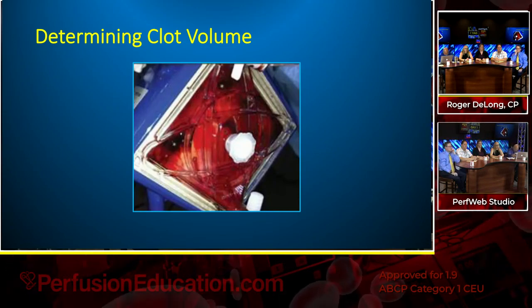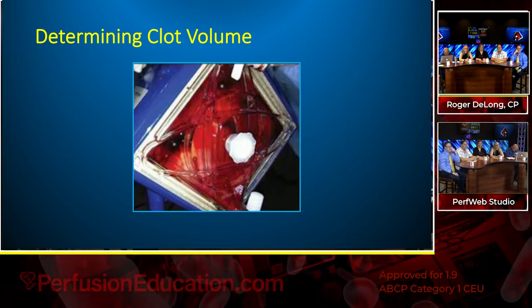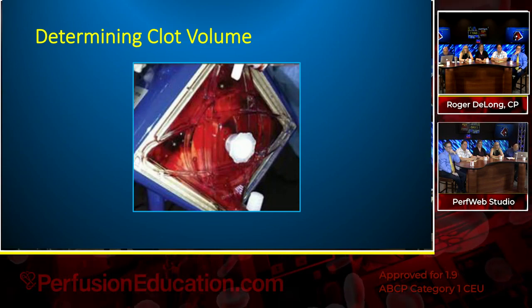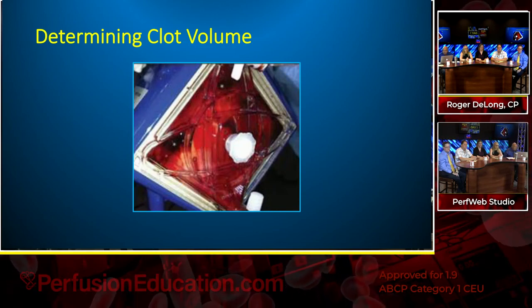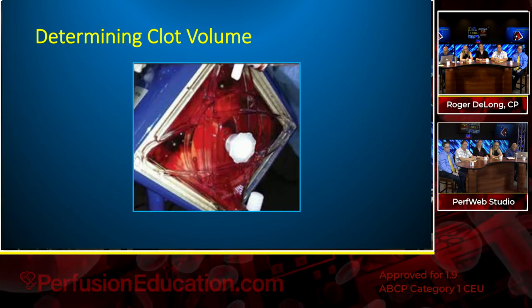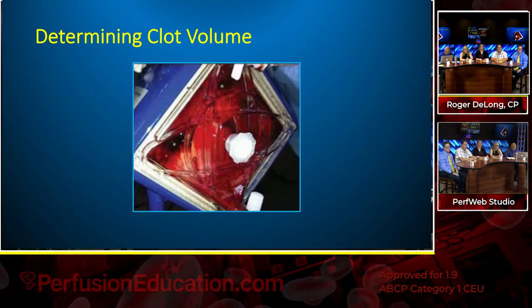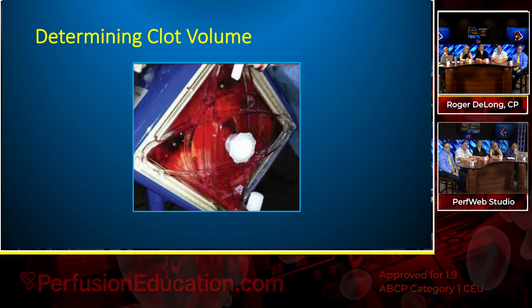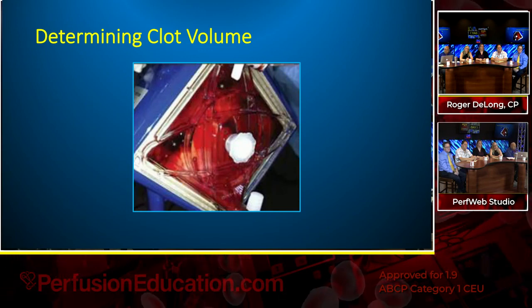The Quadrox has corners. Any engineer that decided to put corners on a hydrodynamic system, in this case hemodynamic system, must have been banging his fist on the table saying, guys, we can't do that. At least I hope they did, because there's no rationale for corners. And this would be a good reason why. The flow is inevitably going to be slower in the corners, and this is a pretty typical shot where you've got some well-developed clot in the corners, and it varies throughout the face.